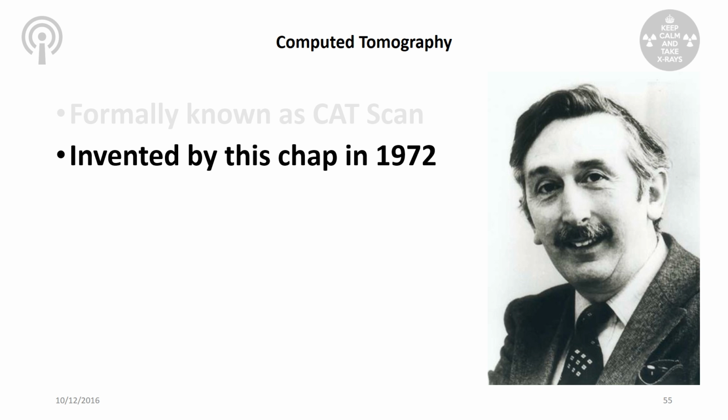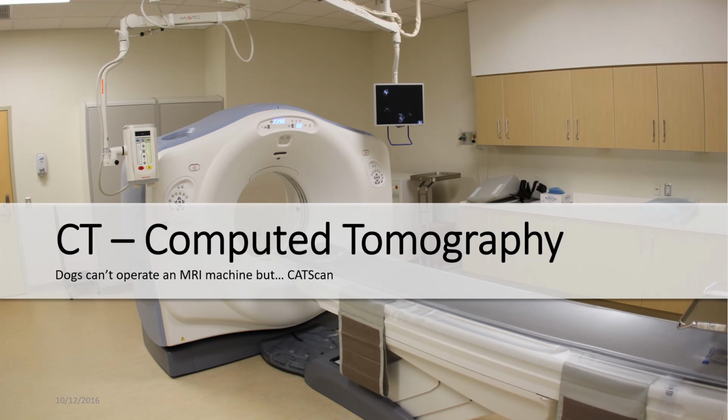And computed tomography, in a very small nutshell, uses a rotating X-ray machine that's collimated to a very thin X-ray beam, 0.625 millimeters thereabouts today, and it has a bank of about 64 to 128, 256 detectors that are all 0.625 millimeters thick, and the detector and X-ray tube rotate around a patient in order to take an image. So it looks very similar to the one there. So the X-ray tube is housed inside here, and it spins around like mental.